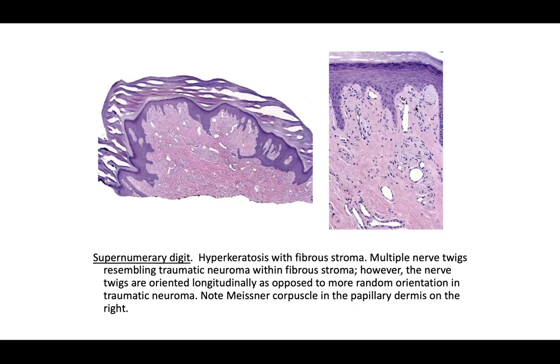If you can see my arrow, I'm circling a Meissner corpuscle in the papillary dermis on the right. These are the sensory organs responsible for light touch.